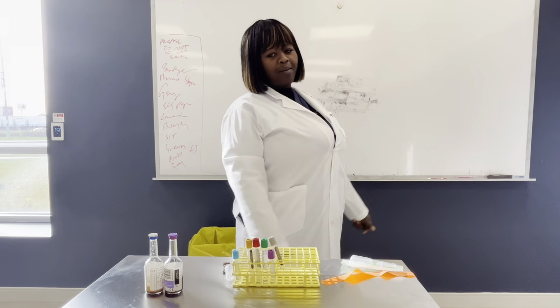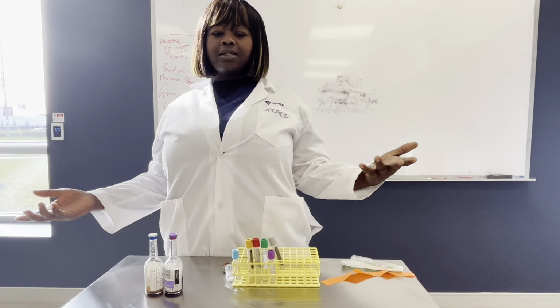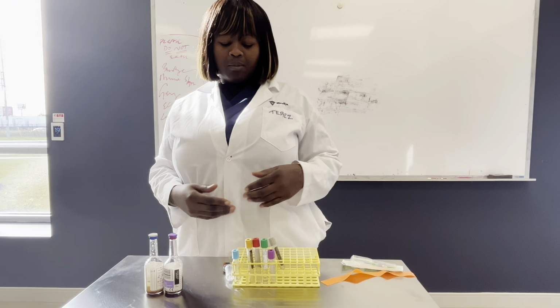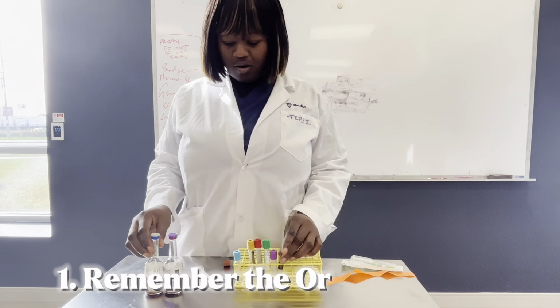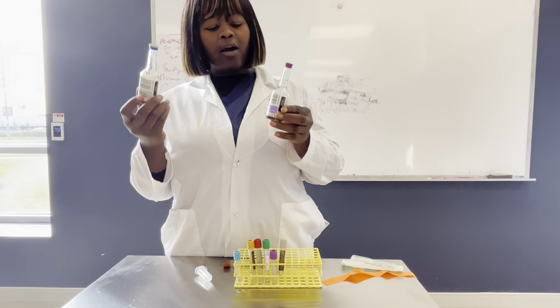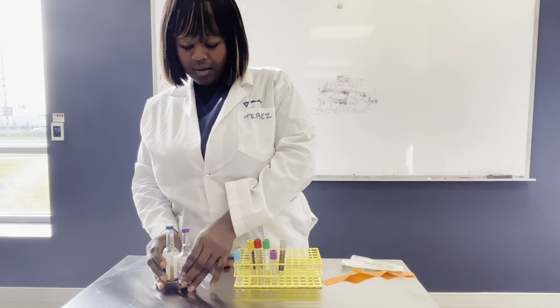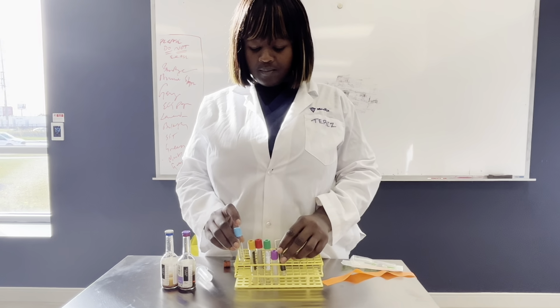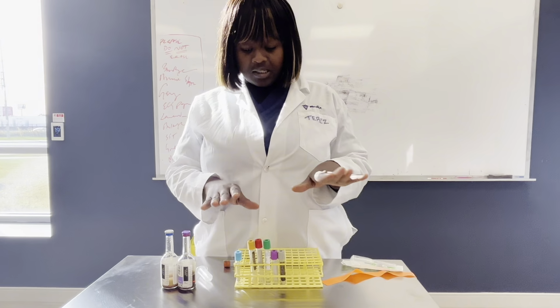So, as I wrap up this segment, I'll share some practical tips and best practices for mastering the order of draw. Number one, mind the order of draw. First, you have blood cultures. Don't forget, aerobic goes before anaerobic. Next, in the order of draw, you have blue. The pretty color always goes first. This is if this is included.